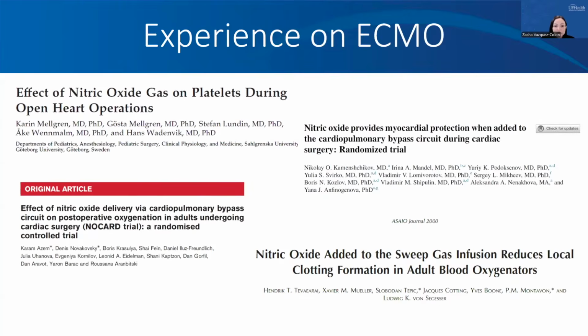Now, we have seen all these studies in the pediatric population, but there isn't much literature in the adult population and the use of nitric oxide in the ECMO circuit. However, there are published studies on nitric oxide in cardiopulmonary bypass in adult patients showing promising results, such as myocardial protection, improvement in hypoxemia, and improved vasoactive inotropic score. These are described in this set of different studies that I'm not going to detail due to time limitation.